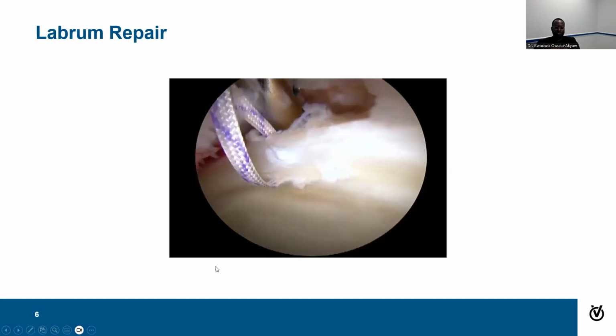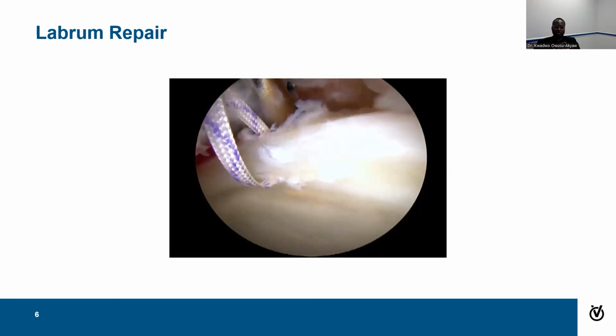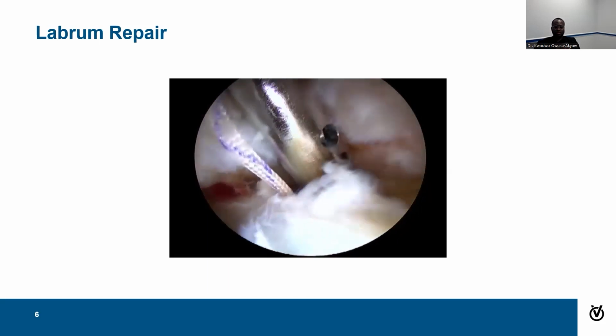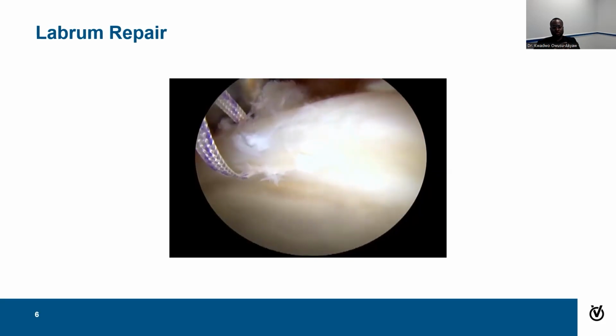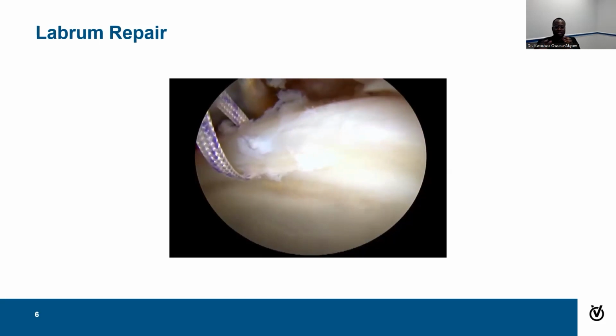Here we go. Okay. So now you can see the metal instrument up top. That's me in the process of drilling a hole into the bone of the socket, or the acetabulum, where the anchor, the plastic screw, is going to go. In a second, you're going to see a change in angulation. You can see the drill going. And there you go. You see the drill spinning in its guide, and that's actually drilling through the bone. When we're doing that, we're checking the cartilage of the joint very closely to make sure our drill is not somehow interfering with or hurting the cartilage. So we watch it very closely under the arthroscope. So we go on to the next slide.